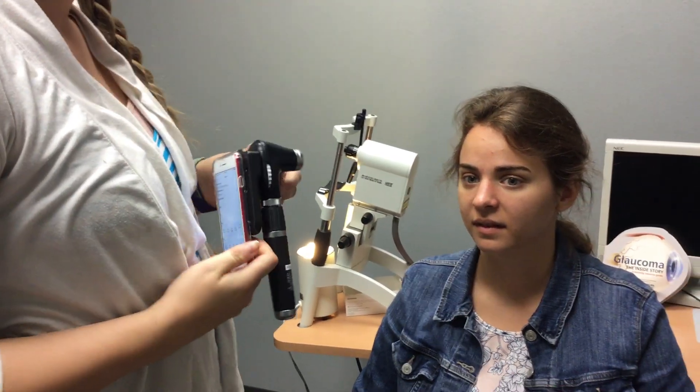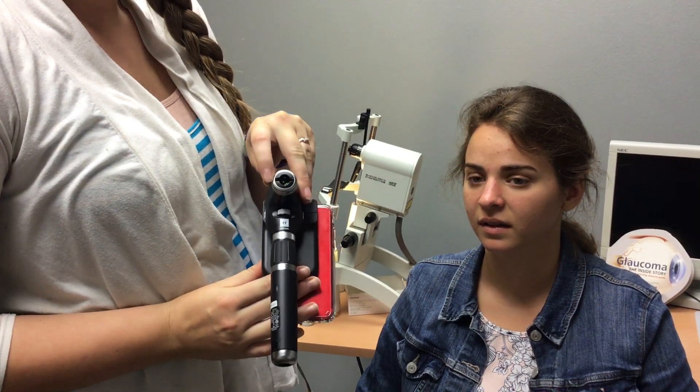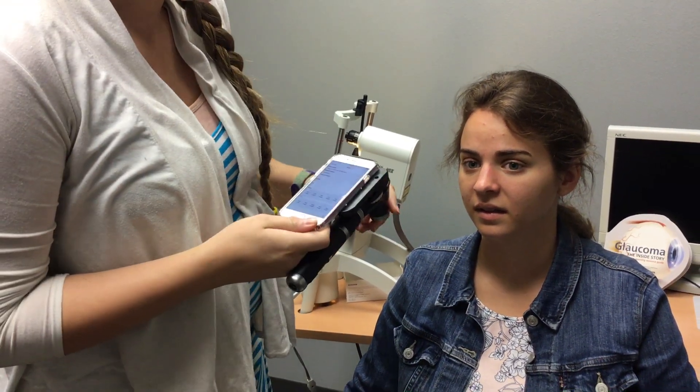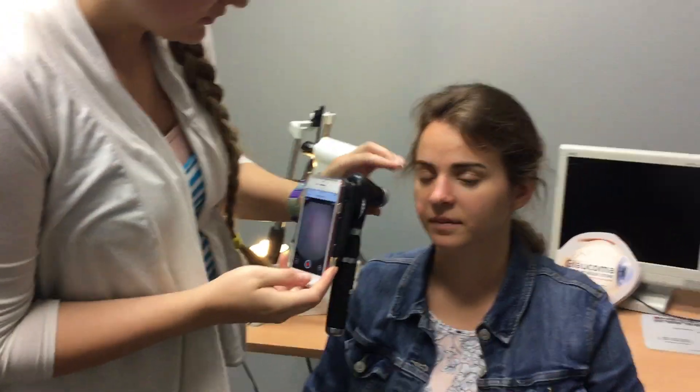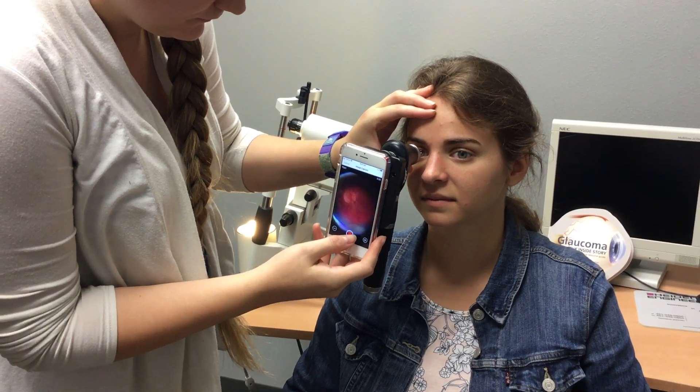If you could look straight forward for me — there are lights in there, but I don't really like to have them look at the lights because I feel like I'm chasing their eye around, so I just have them look straight forward. I'm going to put a light in your eye for a second, so keep your eye open.